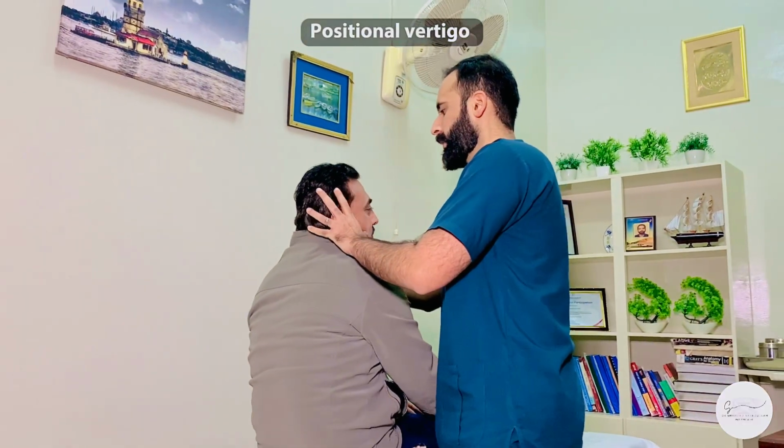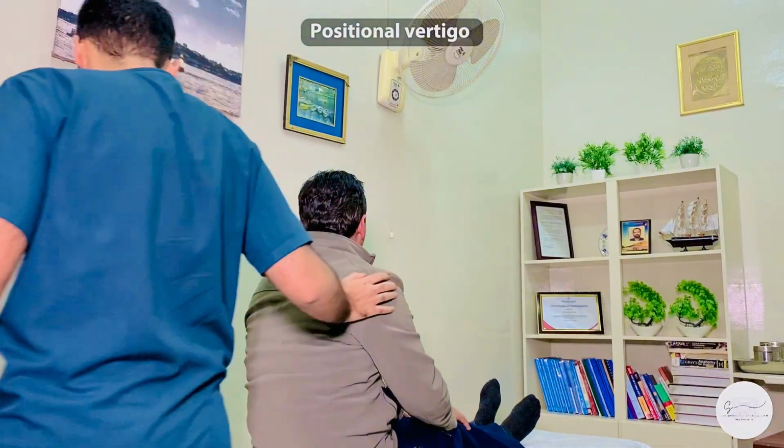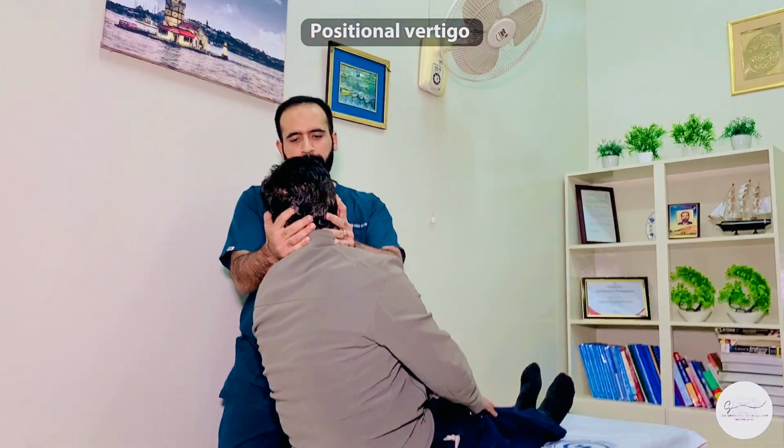Now you will tilt the head to the left. Ideally, I should be coming from the left side. Tilt the head to the left and then bring them back.